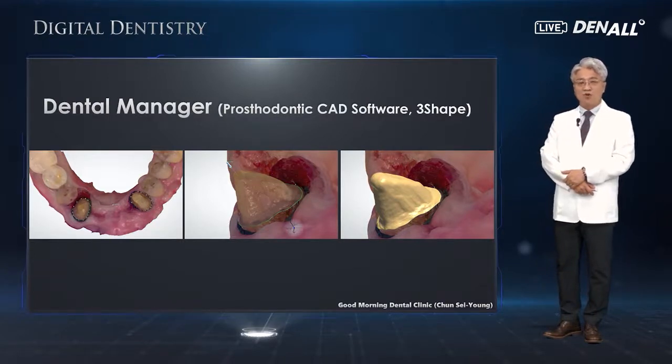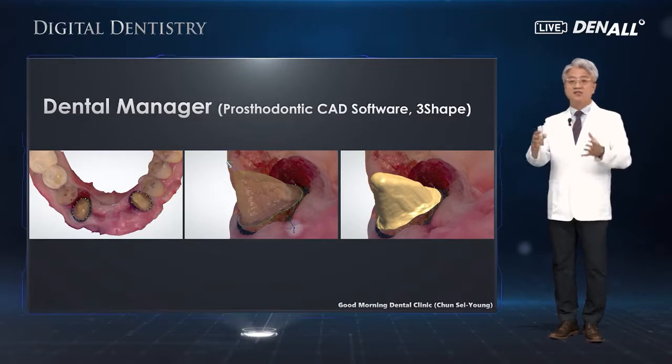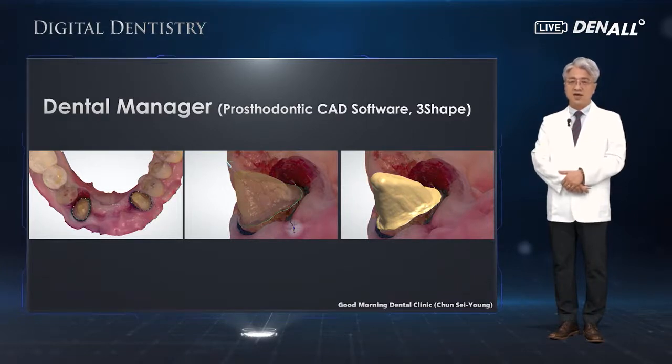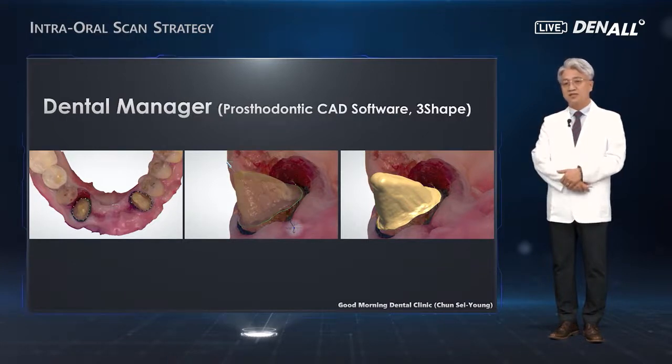You need to find and set appropriate settings for the specific milling machine or 3D printer that you have, so that in the modelless work, the modelless prosthesis can be fabricated and delivered to the patient accurately and in a fast manner.